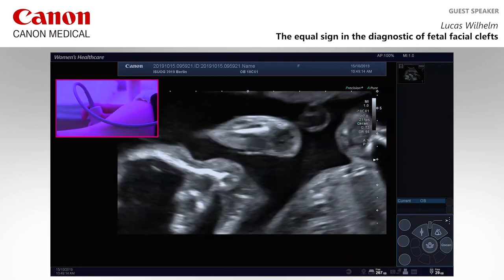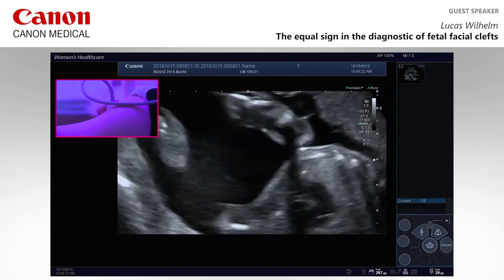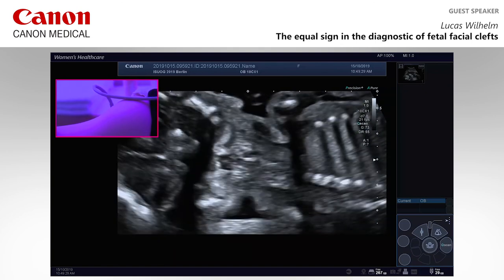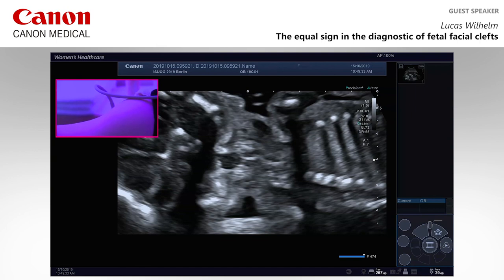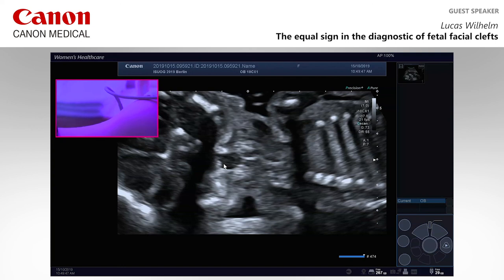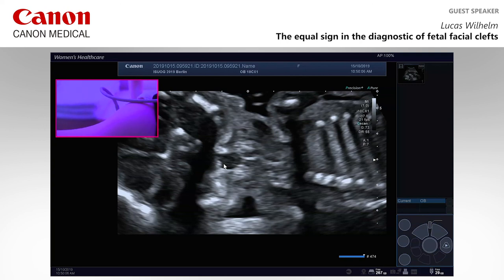Is there anything the audience would like to see? Everyone is deeply impressed watching you scan — it looks so easy. It's not so hard; it's a question of training. You can clearly see the equal sign again. It's very important to train this extensively — you can't use it only in suspicious situations. You have to do it over months with every fetus you see at this gestational age. You have to be very sure with the normal conditions.